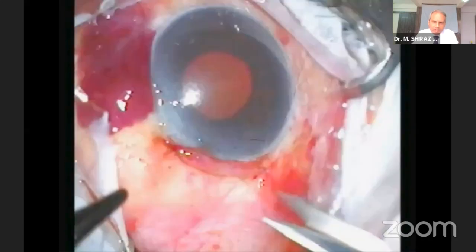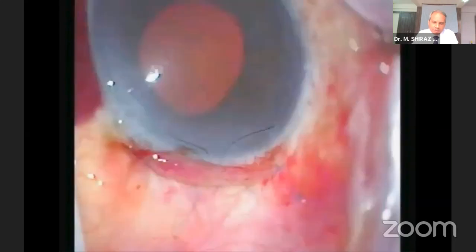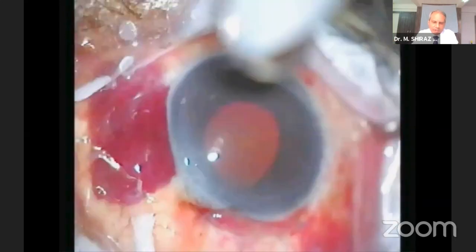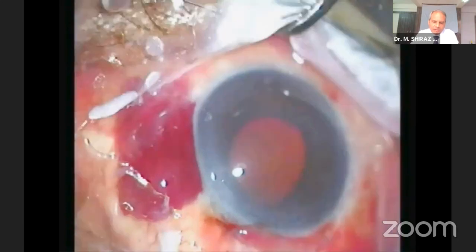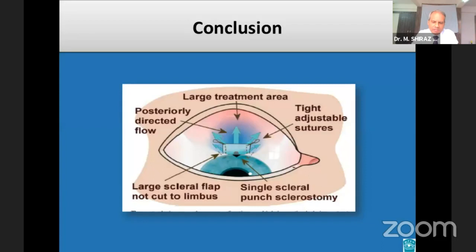After closure of the conjunctival flap, the anterior chamber is deepened by injecting balanced salt solution through the paracentesis. Finally, antibiotic eye drops are instilled and the eye is closed. To conclude, I would like to say that each and every surgical step of trabeculectomy is important and should be done meticulously to achieve the desired outcome.